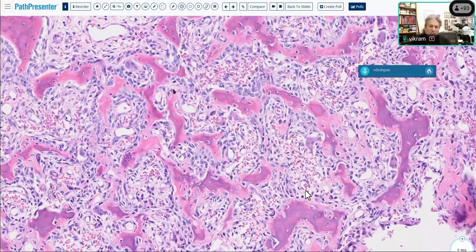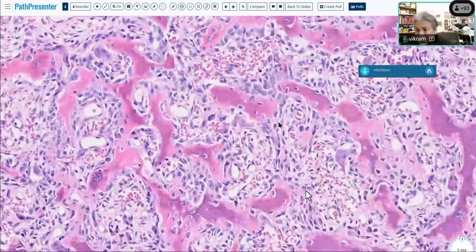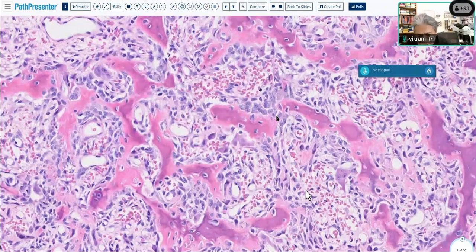So you'll have these seams of bone, and then if you look in between, the cells surrounding this look like osteoblasts, don't they? So generally, when you see osteoblasts around bone, you are not dealing with an osteosarcoma. There is an osteoblastoma-like osteosarcoma, but those are as rare as hen's teeth, and unless you have very bad karma, you won't see one of those.